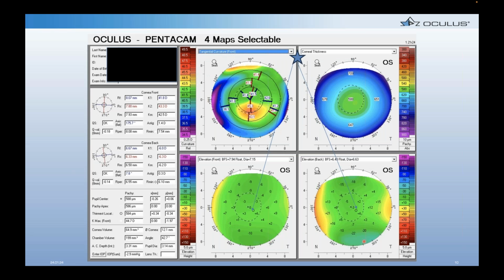We do look at this patient's cornea though, front and back. What we can see is their corneal thickness is quite robust at 588. And our front and back elevations, if we look here where my little highlighter is on the front elevation compared to the back, we see very little difference there. Our back elevation and front elevation are both about +4, so they match. So this patient certainly has some corneal issues, some warpage or whatever is going on. Certainly it's not a regular anterior surface, but this is not due to corneal thinning or ectasia as the diagnosis. So we wouldn't be looking at managing this patient for keratoconus so much as we'd be trying to discern why their corneal surface is irregular and try to manage it that way.